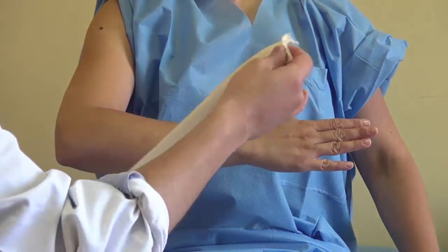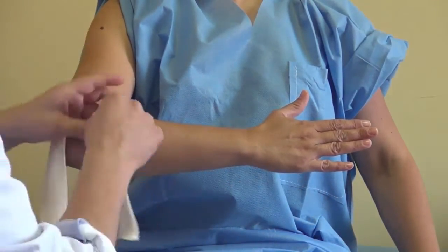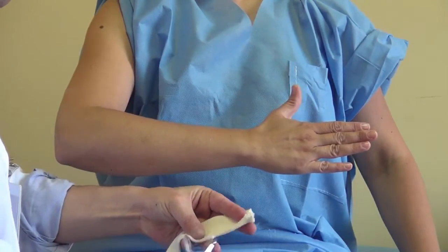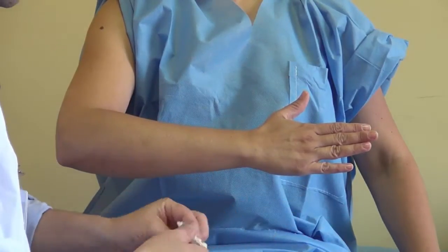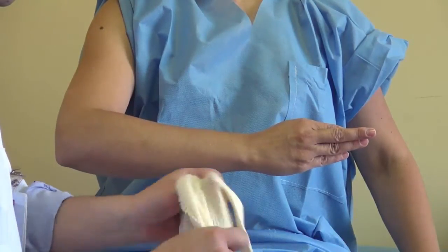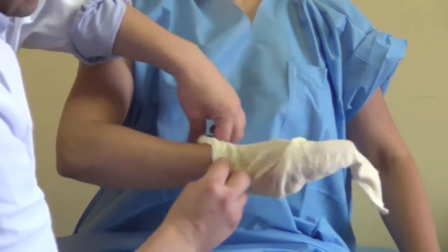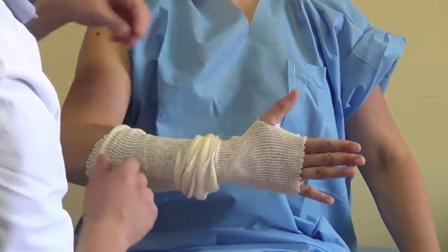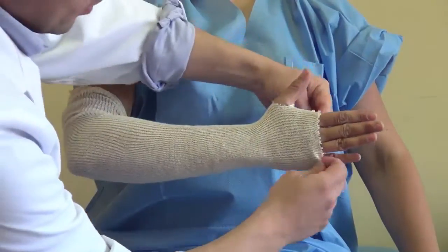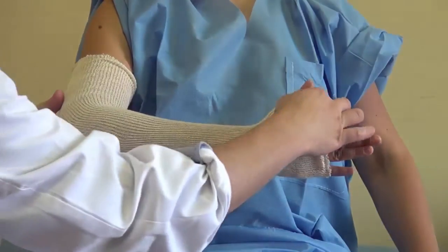First, we take the tubular stockinette around the arm — we take a little longer over the arm. We make a small incision to take the thumb out, and we place it around the arm, making sure to cover over the elbow and to leave the thumb free.